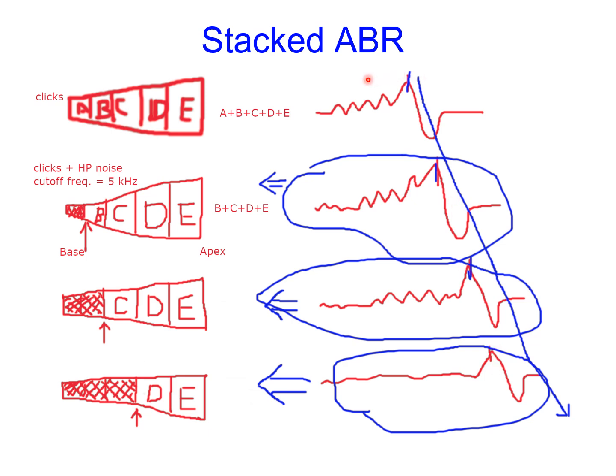So when we do a series of ABR recordings, the wave 5 latency will be prolonged as we change the cutoff frequency of the masking noise from the basal end to the apical end, that is, from high frequency to low frequency. So when we decrease the cutoff frequency of the masking noise, the ABR latency will be prolonged, like this here.